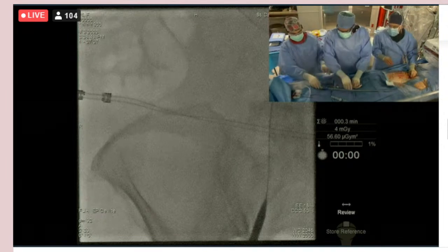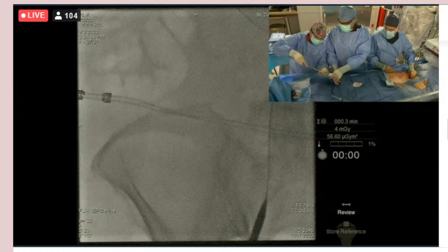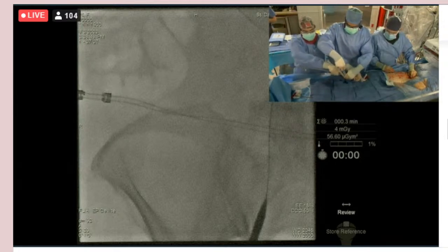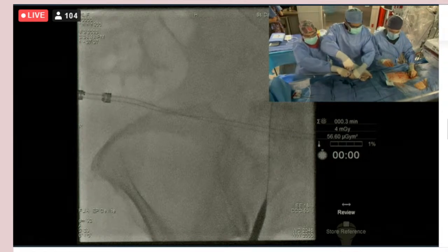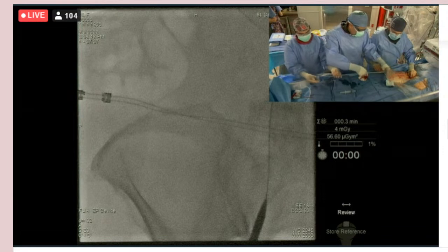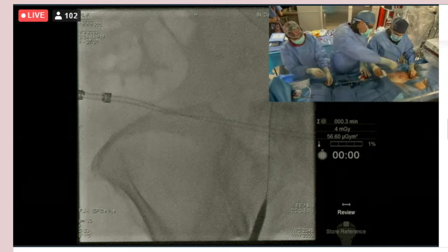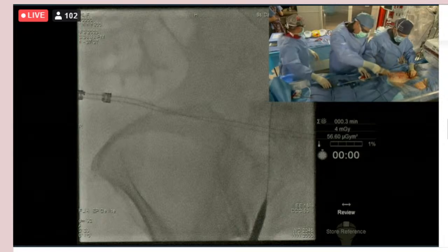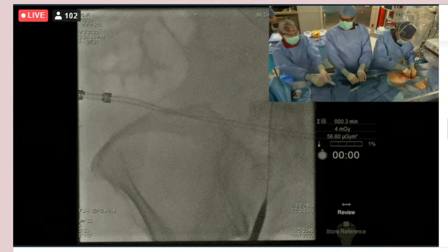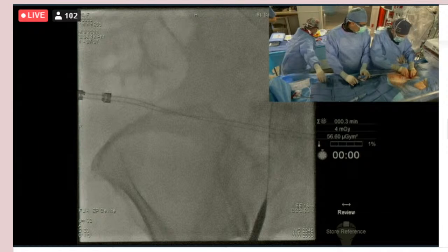Okay, so the Medtronic, can you hear me okay? I'd like to really wet this one down. That's the microsheath you're putting in now? Going in now. Okay. And any tricks on putting this sheath in? For me, two things. We wet it, and then we pre-dilate. Are you one of the people that rotates it in, or you just kind of push it in? I push it in, and I do some rotation.